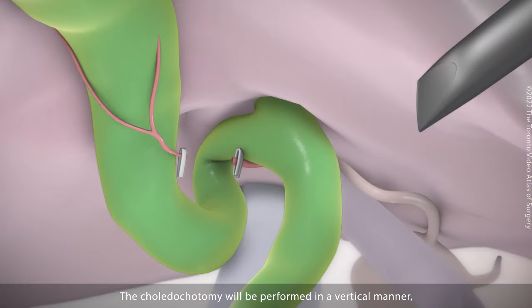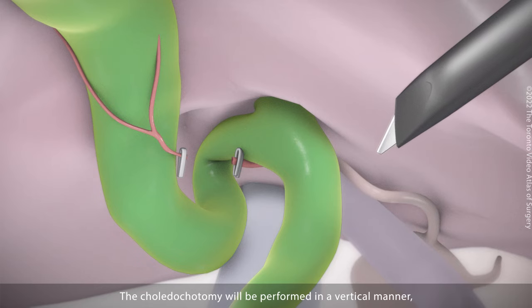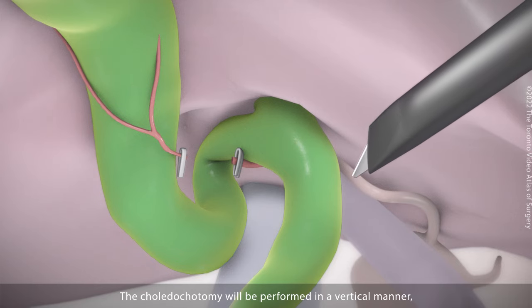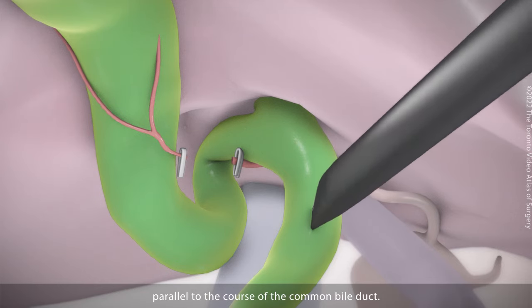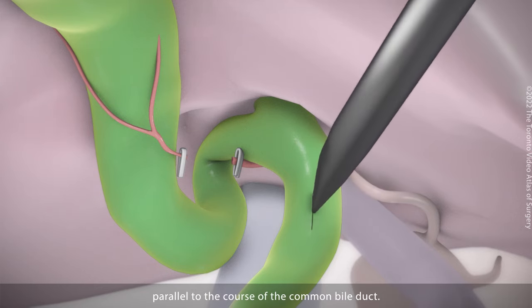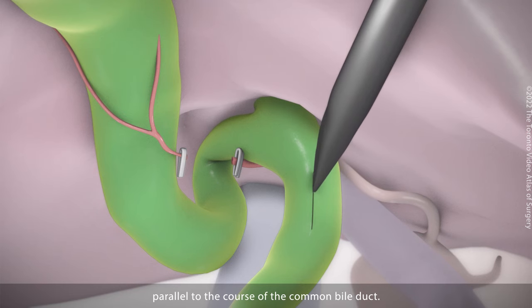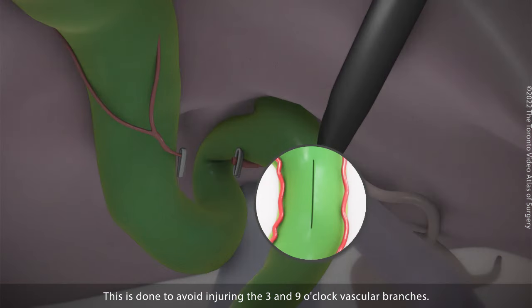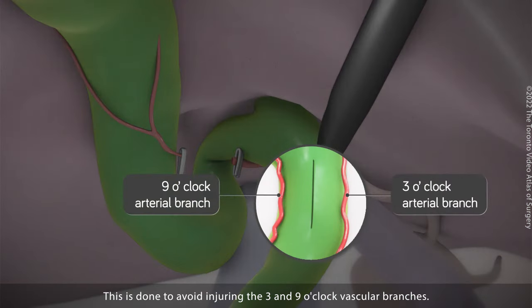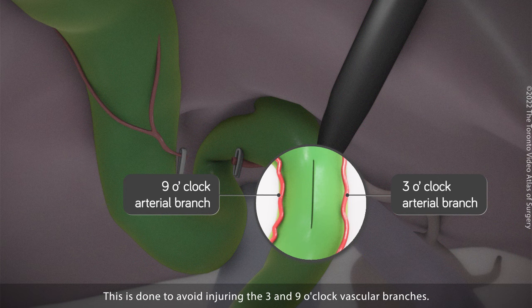The choledocotomy will be performed in a vertical manner parallel to the course of the common bile duct. This is done to avoid injuring the three and nine o'clock vascular branches.